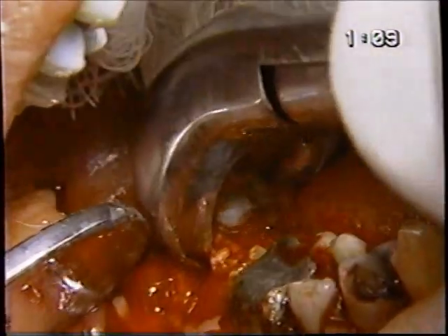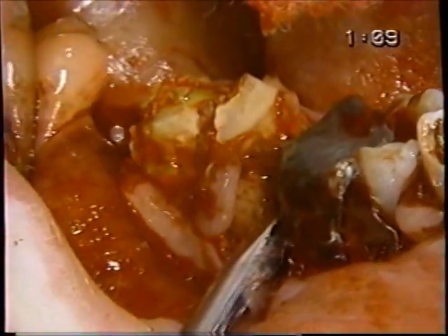Even with the cow horn, the crown is so decayed that it's losing my grip with it, but since it is holding somewhat, I'm doing a little luxation with it, even though it's probably going to break out. Let's use the 34S and see if we can't get it up. Okay, universal 151.